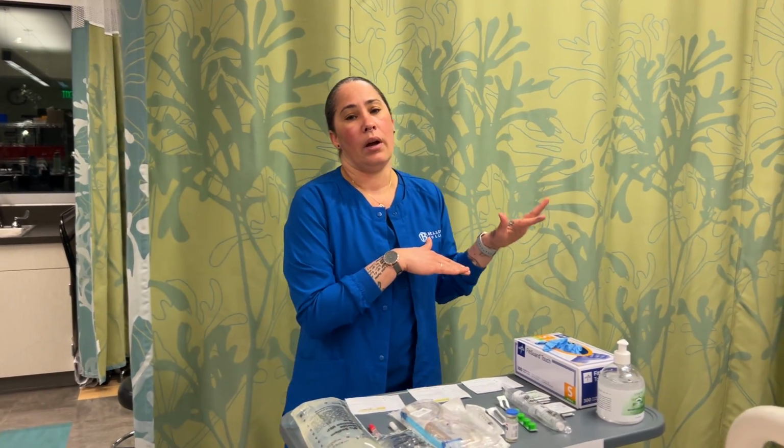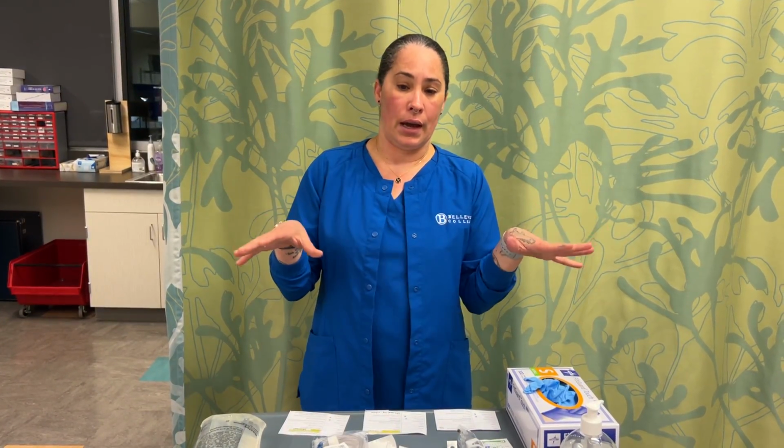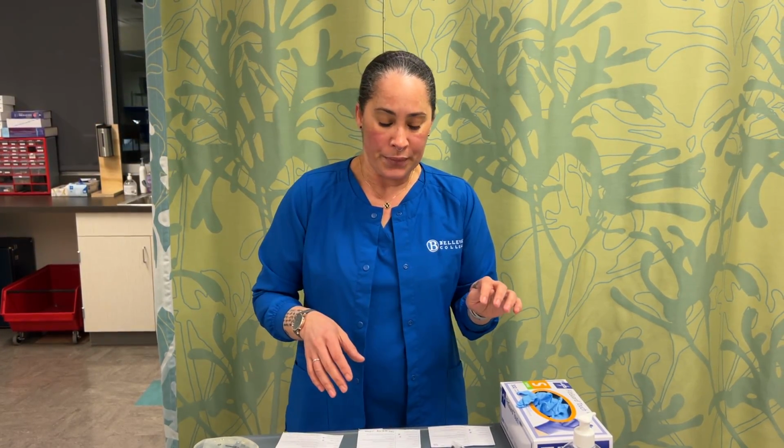Usually in the med room they will have a computer system, so you want to get on that computer system and check again to make sure that you have all the right meds and all the right supplies for what the doctor has ordered for your patient. Once we do all of that, we are going to gather our supplies, checking with the MAR and the medication that comes out of the med room.